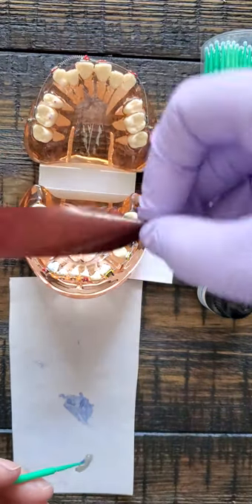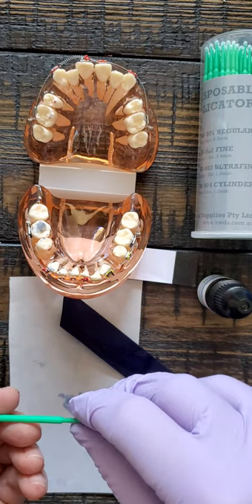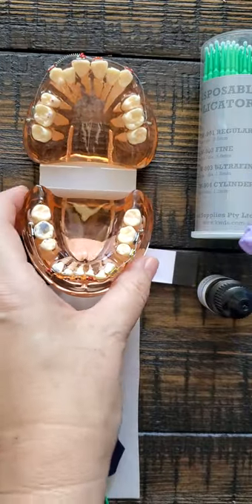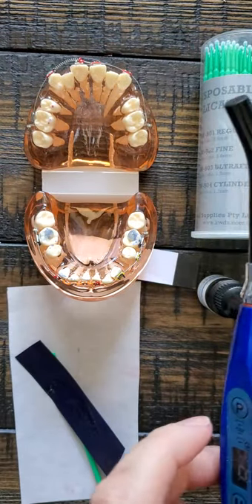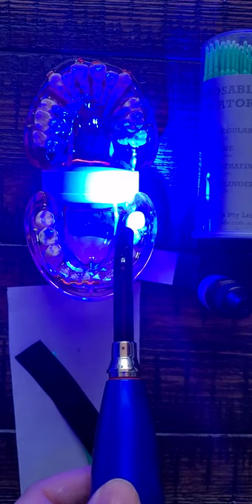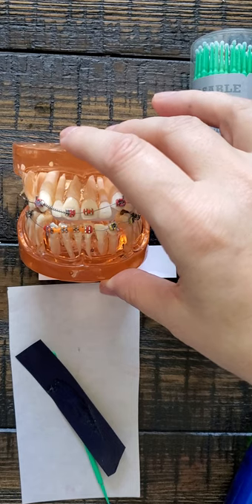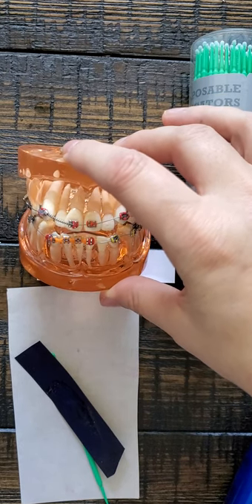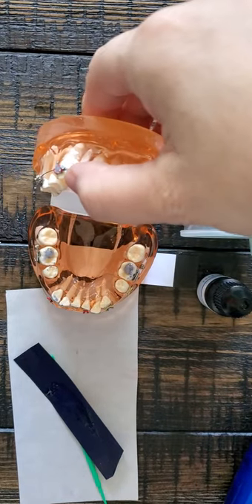I lost my articulating paper — here we go. I don't do red because red looks like blood and patients freak out with that. That way I remember to take them off if they're blue. Just kind of turn it blue — it's a little messy. Now let's go ahead and light cure this one. We're done light curing. Let's see if this did the trick. It's probably a little overdone, which happens and that's okay. Honestly, they're probably going to fall off anyway. If not, the patient will wear them down. This will definitely do the trick. They're blue, so they're really easy to notice.